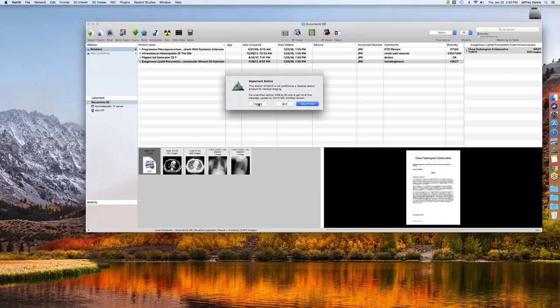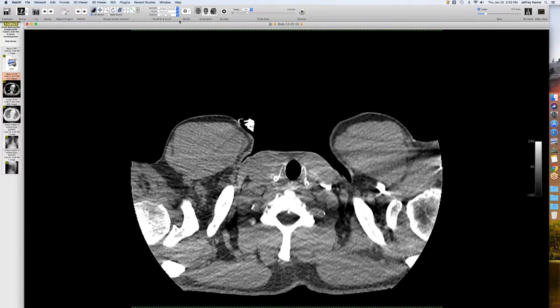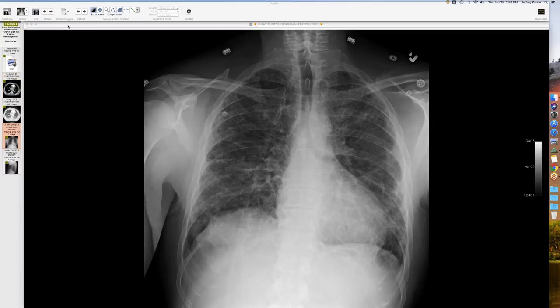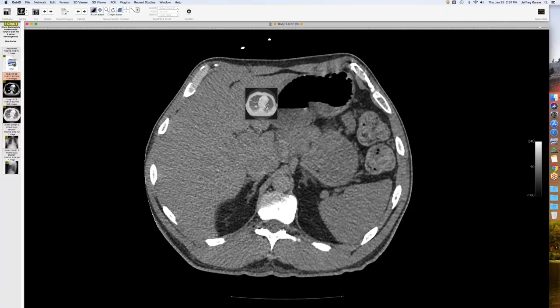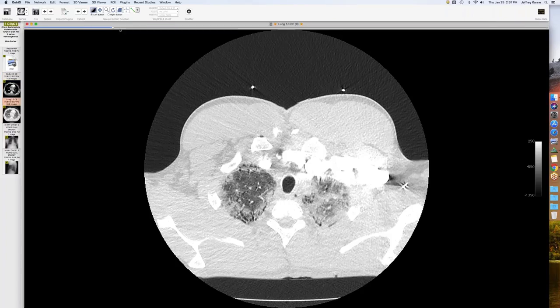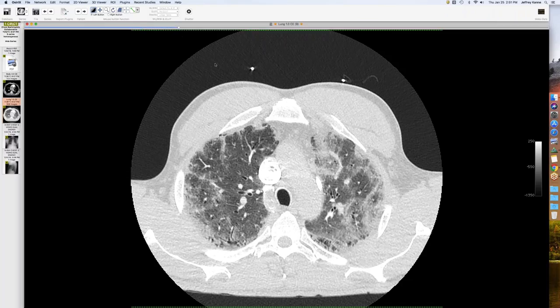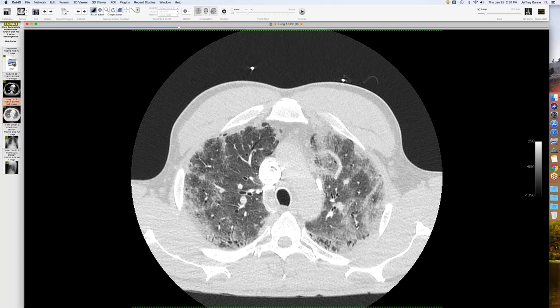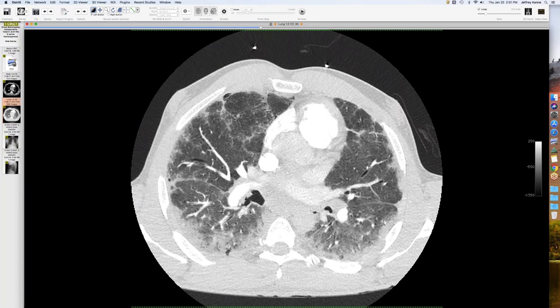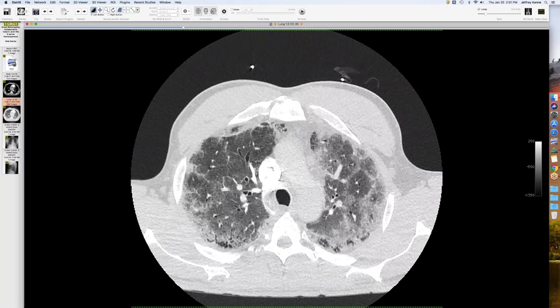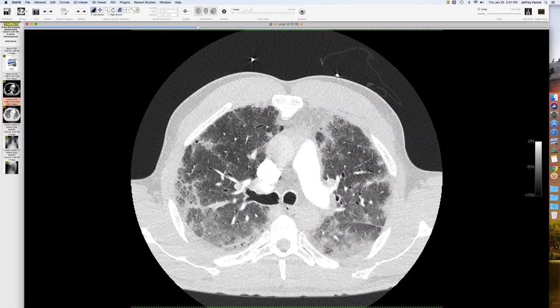This is a middle-aged guy with psychiatric diagnoses and chronic, worsening lung disease presenting with shortness of breath. His lungs have a granular appearance with upper lobe scarring. CT shows large pectoralis muscles and an almost arcading appearance — bands of consolidation, patchy ground glass, a little distortion, and cystic spaces along airways in the upper lobes. He carried a history of drug use — specifically, he injected intramuscular mineral oil to make his muscles look bigger.